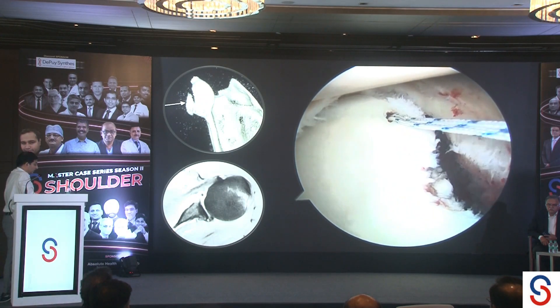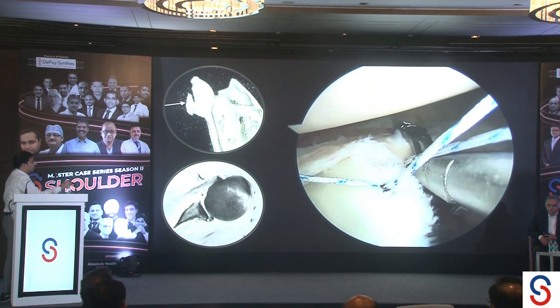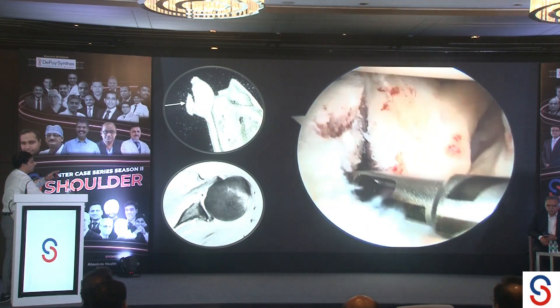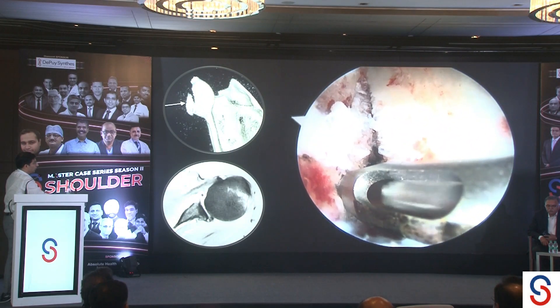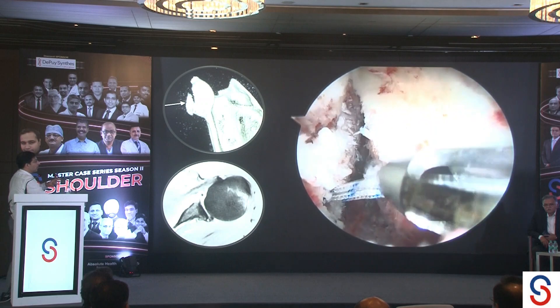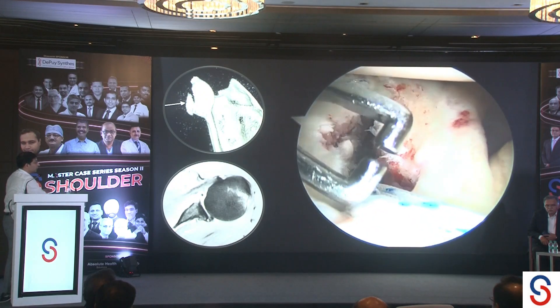This is an all-suture anchor placed about a millimeter off the face. The first bite goes through the labrum just below the bone junction, allowing an indirect reduction — this suture will bring the fragment up. You don't want to tie it down at this stage because you still need to place the medial row anchor. Using the curved device through the same portal, I place my anchor on the crater on the medial aspect. With a straight delivery device this would be very difficult and would require an additional subscapular portal, but with the curved device everything goes through the rotator interval.